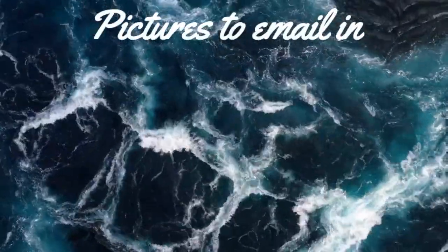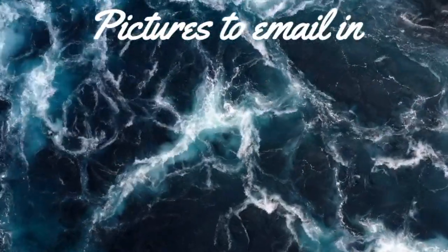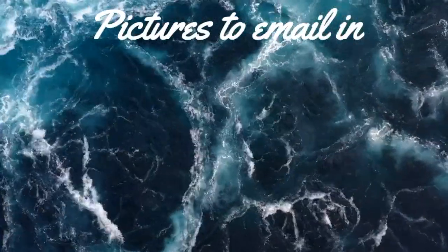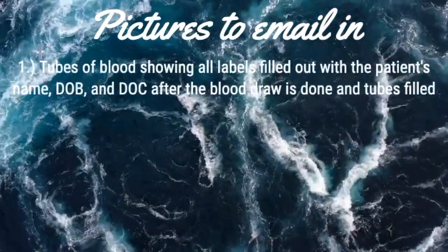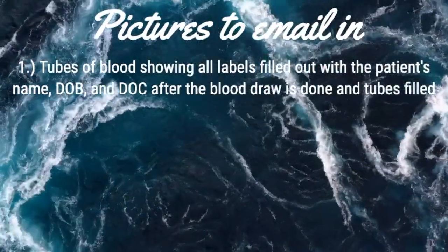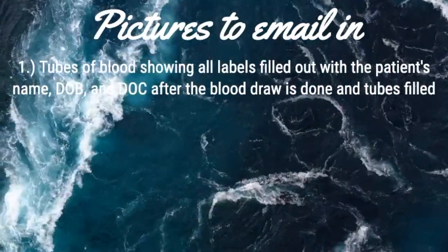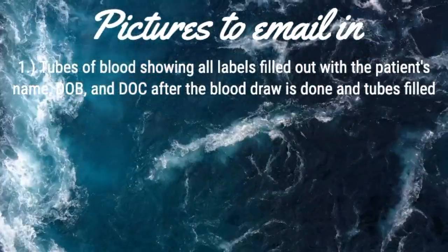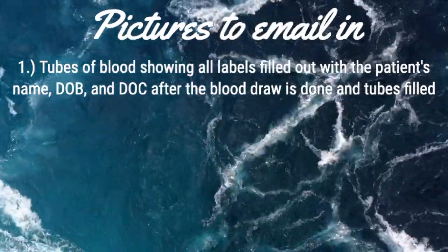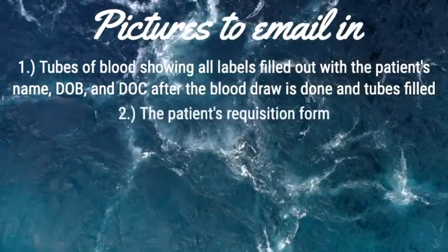Now for the pictures we have mentioned a few times that we need upon the completion of getting the specimen. These pictures are needed since you are out in the field by yourself, and we have to monitor everyone's work for clinical purposes. The first picture is the specimen tubes, filled if the full collection is made, or empty if no specimen was collected, showing all the tube labels so we can see the patient's name, date of birth, and date of collection on every tube. Any large labels wrapped around the tubes can be removed for better labeling of the tubes and pictures.